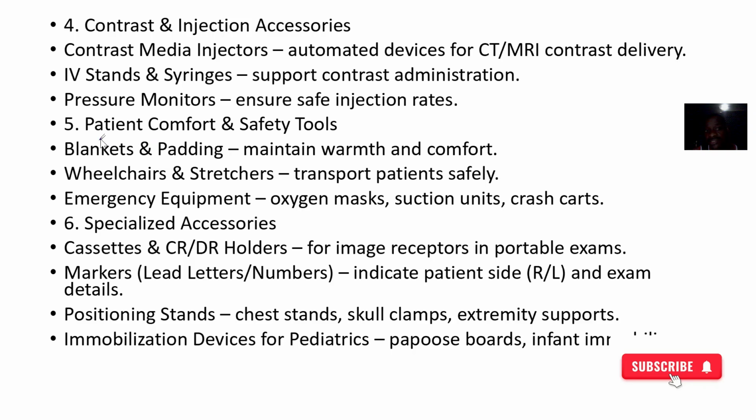Then we have all those things for patient comfort and also their safety, like the blankets, the padding, the wheelchairs, the stretchers, emergency equipment like oxygen masks, suction units, crash carts. The specialized accessories like all those cassettes, CR, DR holders. We have the markers, we have the positioning stands, then also immobilization devices for pediatrics.